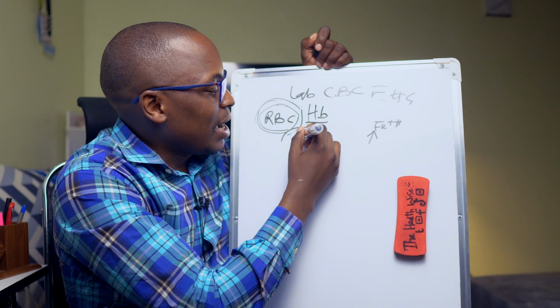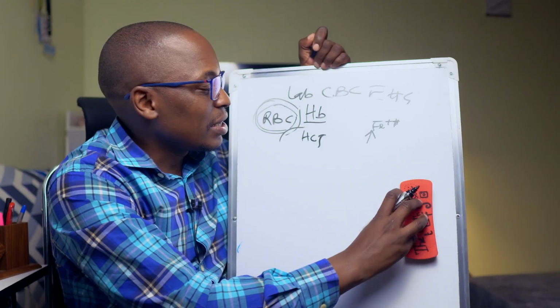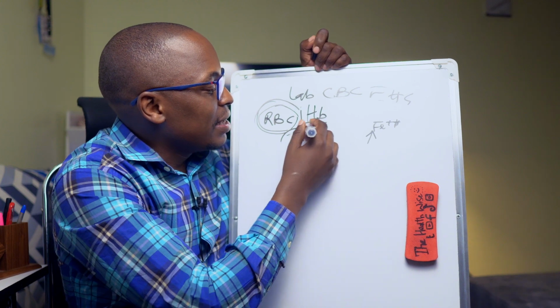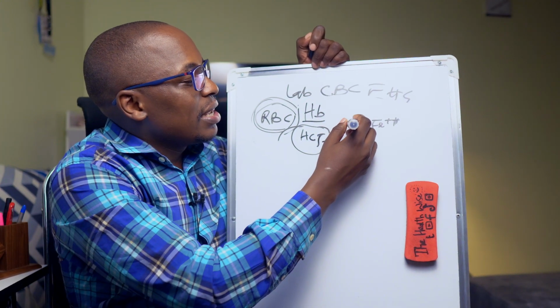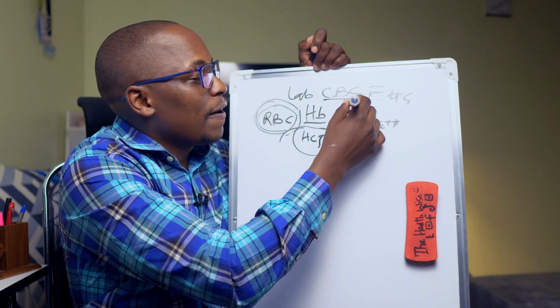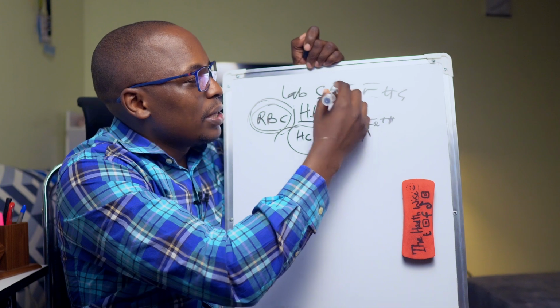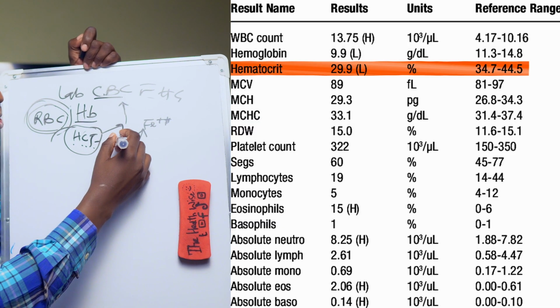And we have something like the HCT, very important, something I know is interesting too. You can have this HCT as a separate test, but it is still included in the full hemogram report that your blood was taken for. So someone will come, prick you, take blood, put it in a tube, and then they go measure all this. One of those will be HCT. This is hematocrit. It's given in percentage.